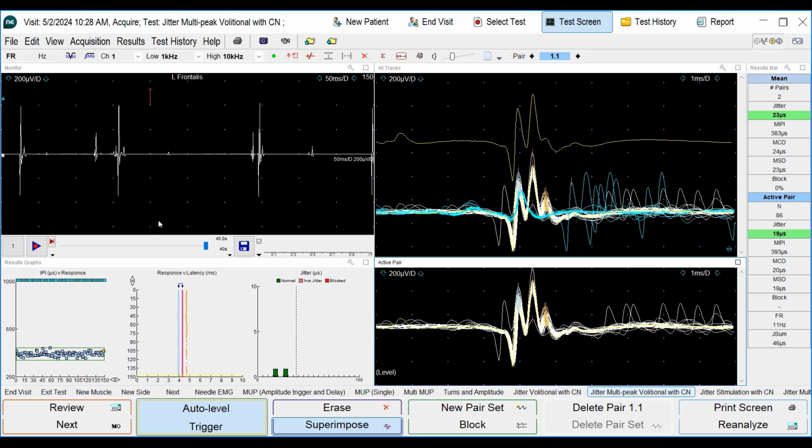Let's just start with the normal way that we are accustomed to. So I will turn this thing off. One of the things I would like to emphasize is that we are not getting rid of anything that we were used to. We are simply introducing new things, and we can decide whether we like it or not. So now I can actually set up the trigger level over here. Let's play the signal.